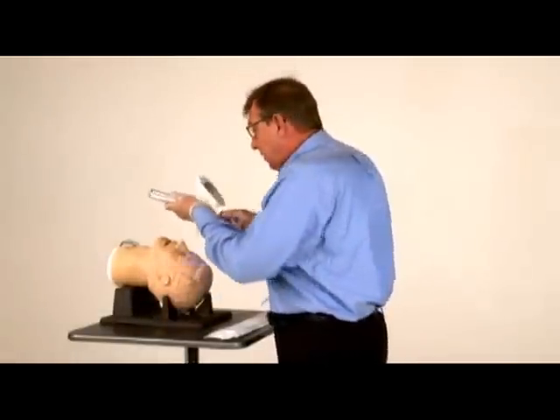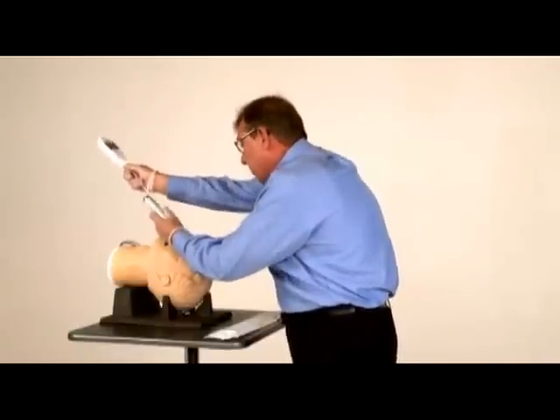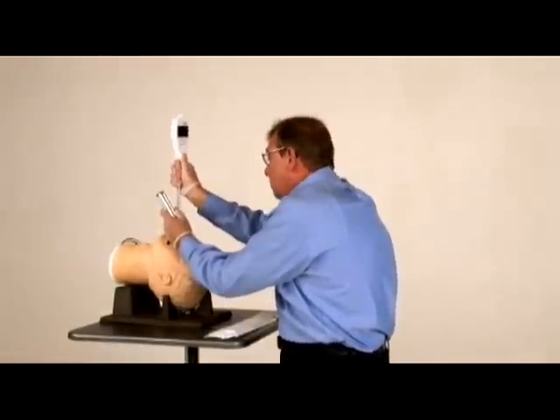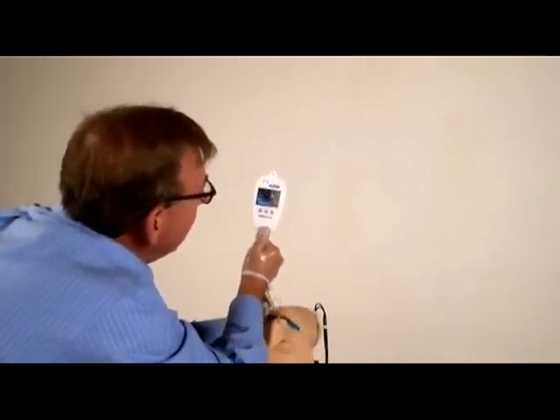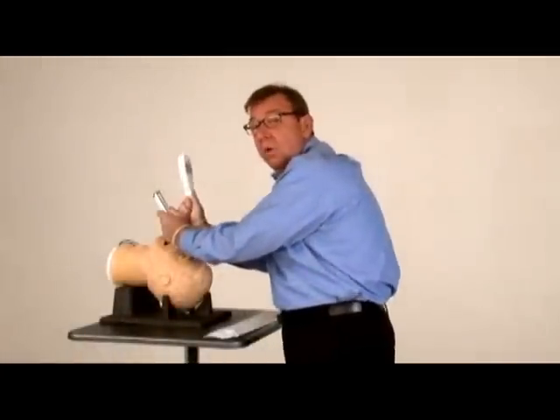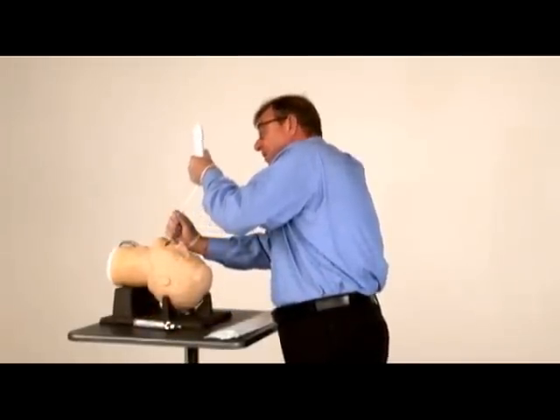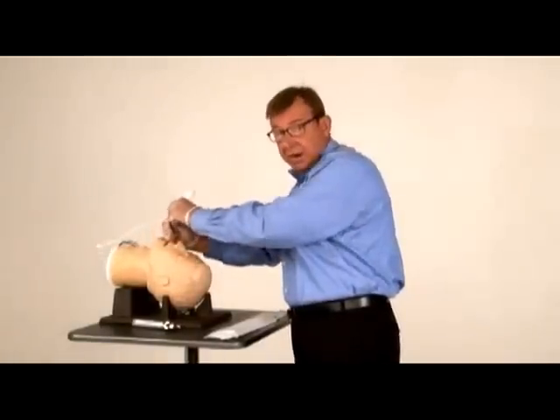We insert the laryngoscope, then follow with the tube and stylet, get a good view on the screen of our cords, and just slide it right through. If you need to, you push forward on the screen so that you're able to maintain a direct line-of-sight view. Once you've seen the tube go through the cords, you remove the stylet.